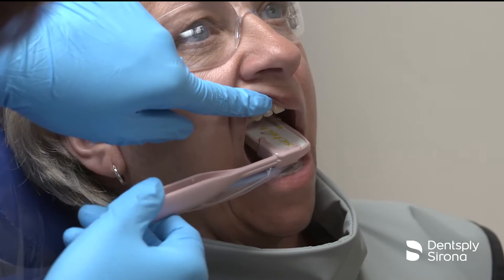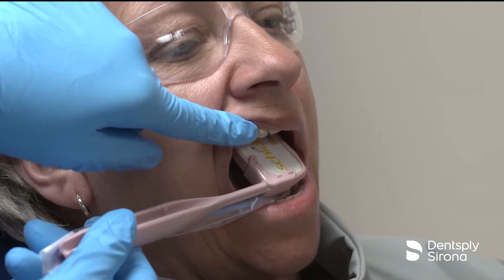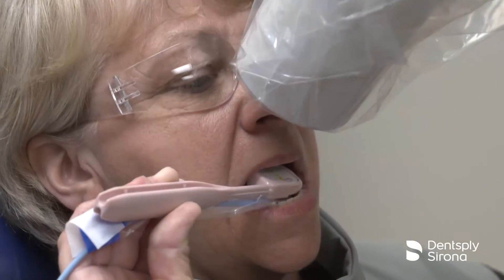Position the holder in the patient's mouth and have the patient hold the comfort wand holder in place. Align the PID and the image is ready for exposure.